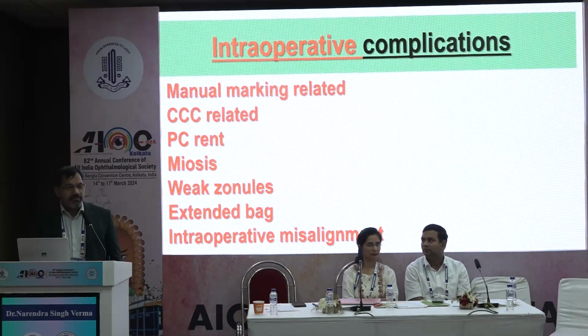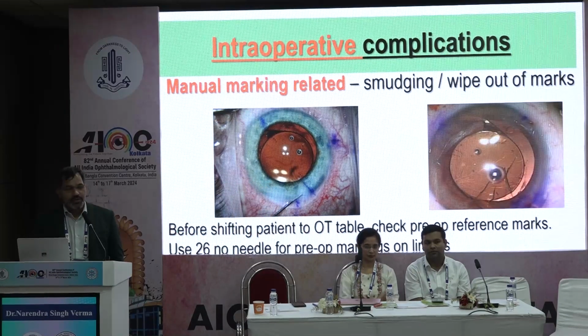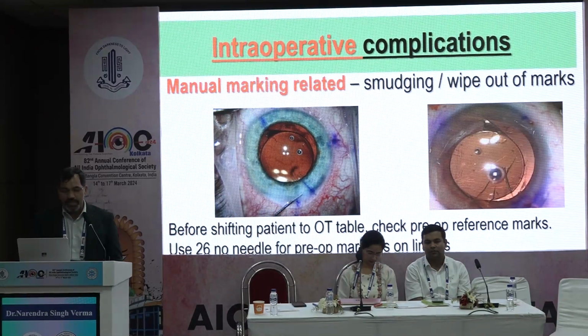Though every time we will not get an uneventful surgery, sometimes there are complications. These are some of the complications. We will see how we will manage these complications. So when we are doing manual marking, there may be a smudging or wiping out of the marks.